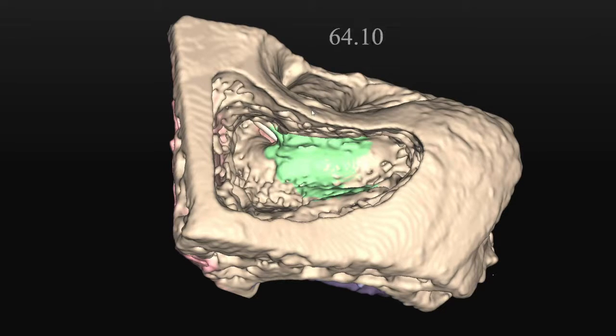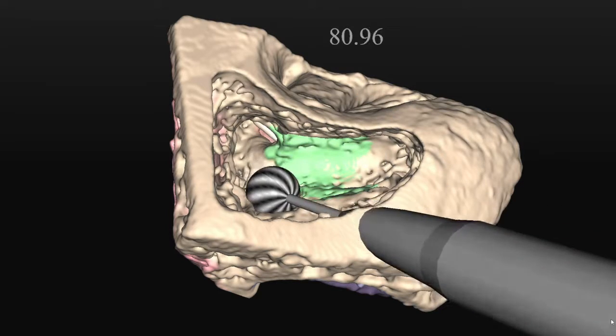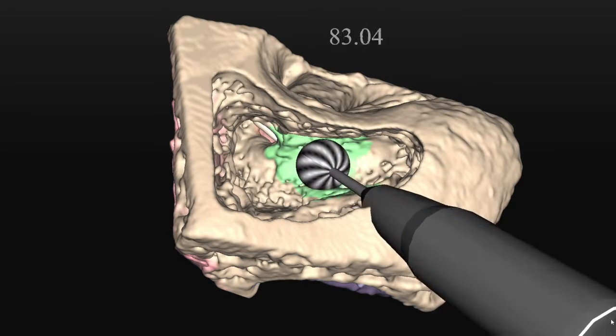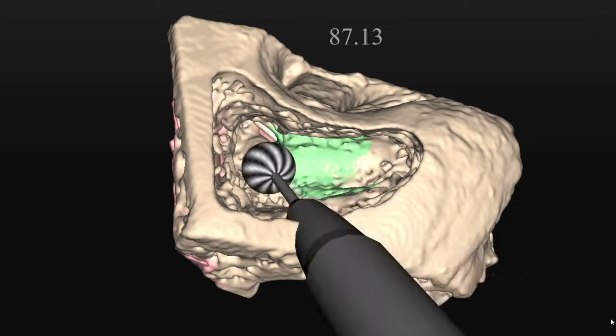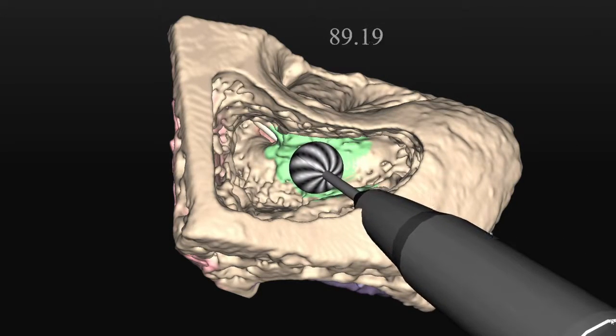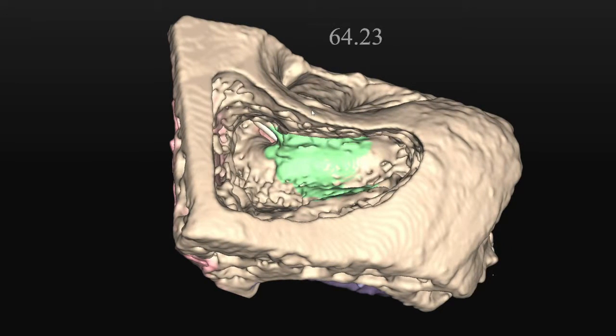The first of these modes is the instruction mode, which will take you through the procedure with step-by-step advice. The real-time instructions will be provided in two forms: verbal advice that tells you what the next step is, and visual cues that accompany the verbal advice. Thin down the buttress slightly and delicately remove the bone along the course of the facial nerve.